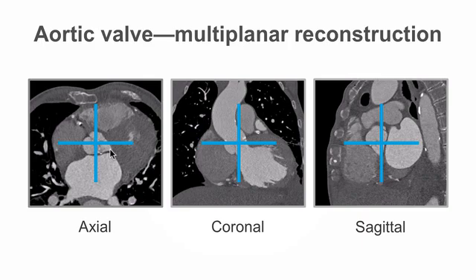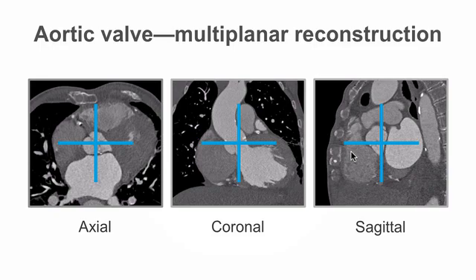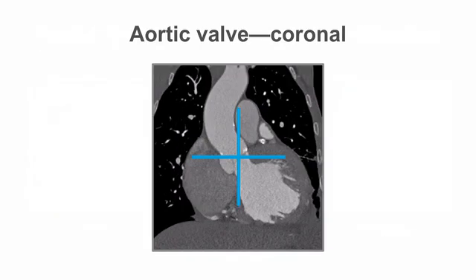The first step to evaluate the aortic valve is to use multiplanar reconstruction and to position your crosshairs over the aortic valve in the axial image. Once this is done, the crosshairs will appear over the valve in both the coronal and sagittal views. Multiplanar reconstruction enables visualisation of a structure in three planes simultaneously. Once this image has been obtained, the crosshairs in the coronal view can be rotated to align along the axis of the aortic valve, as shown in this animation.